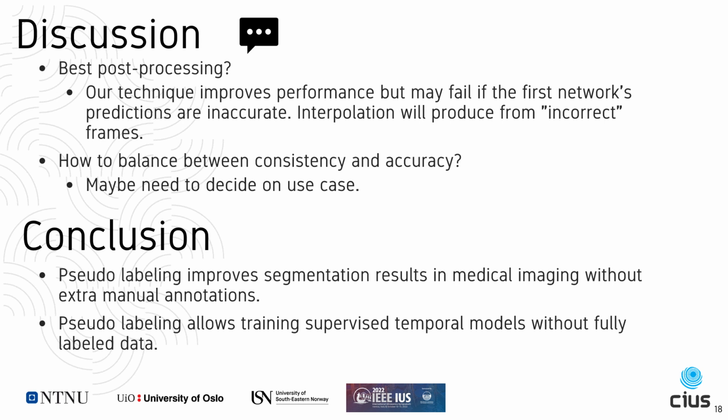In conclusion, pseudo-labeling is a practical approach in medical imaging segmentation tasks to improve segmentation results, especially for those that lack manual annotations. On the other hand, pseudo-labeling also provides the possibility to train supervised temporal models when the fully labeled dataset doesn't exist.